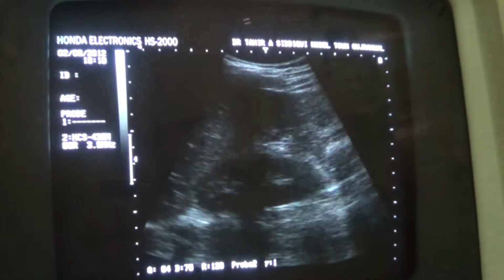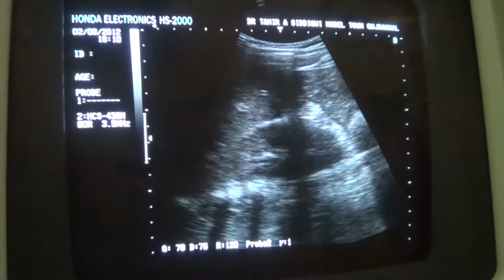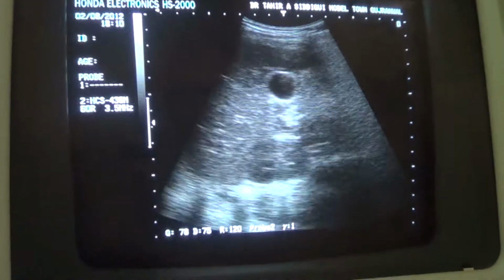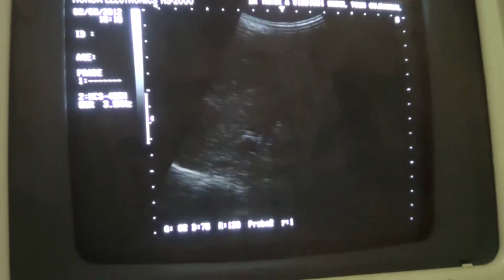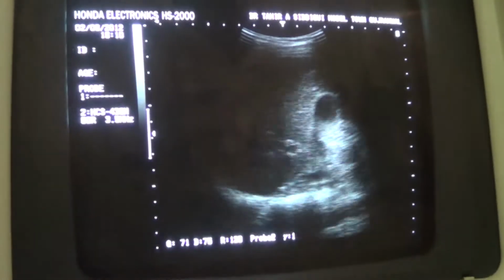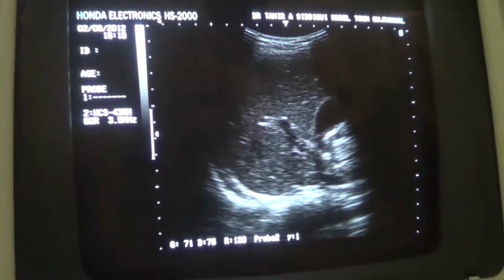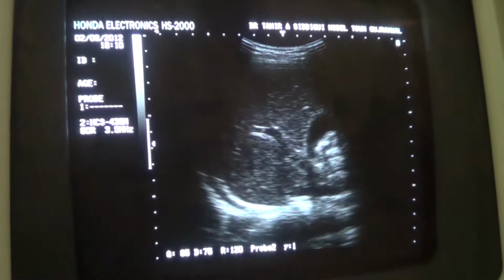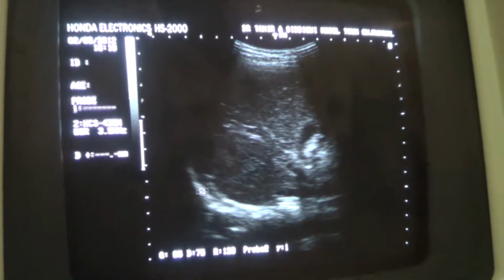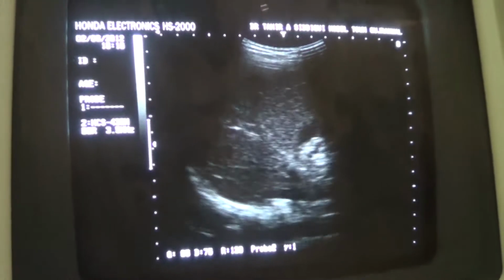Now, by itself, the kidney is seen normal, gallbladder normal, portal vein is normal. There is no dilation of the intrahepatic bile ducts. There is no focal lesion in the liver. There is no pleural effusion, no fluid seen above the diaphragm. Though, in my experience, I will say that there is some fluid more than normal above the diaphragm, but generally we don't report this.